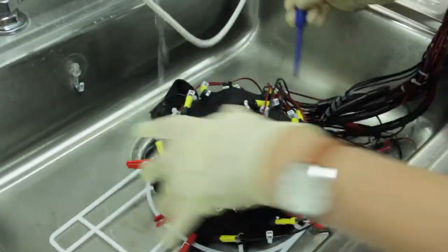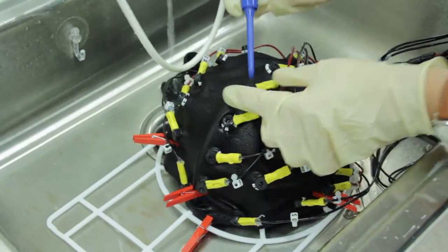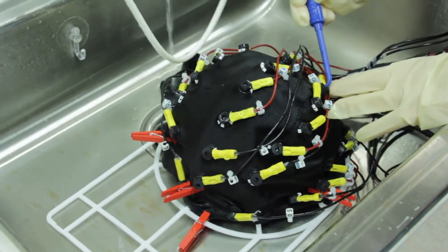Flip the cap over and water jet the outside of the electrodes. Again, make sure you go row by row to ensure you don't miss an electrode.